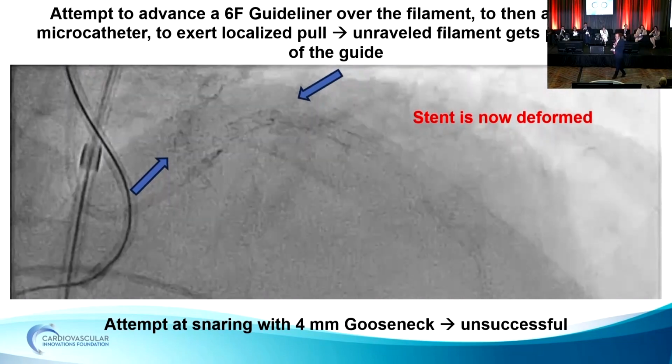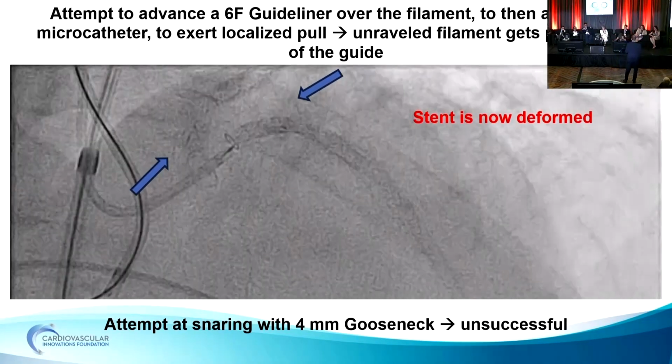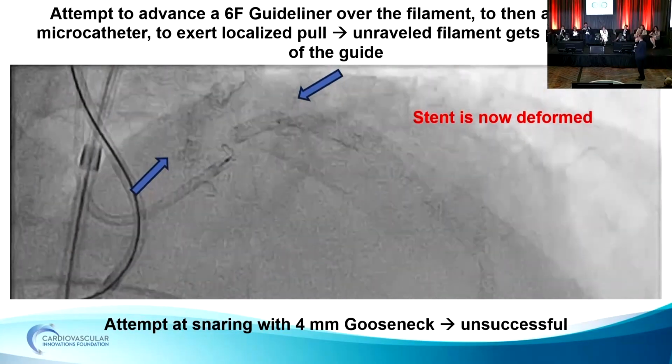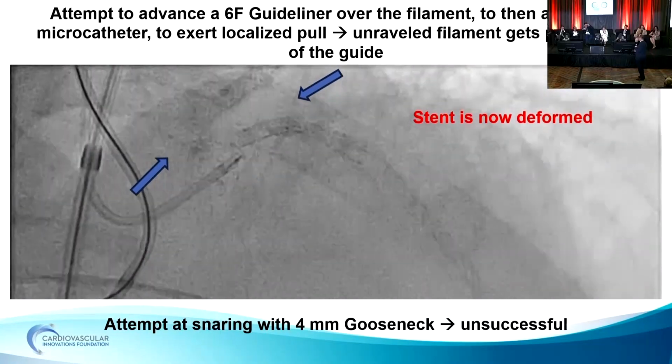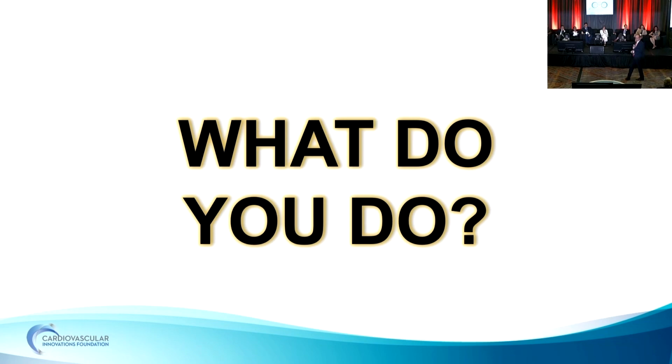Fair. It's hard to say if you can trap the unraveled wire, because it's going to be, as you said, so thin. I wonder if the balloon will keep it in place, because you can definitely keep a whole wire in place, but that unraveled, do you think the balloon will trap it in the guide? That's the question. Rewiring, and then you could take a balloon to now deep seat the guide. Yeah, the guide extension catheter next to where your entrapped wire is, and then with that balloon inflated with the guide extension catheter, pull it back together.